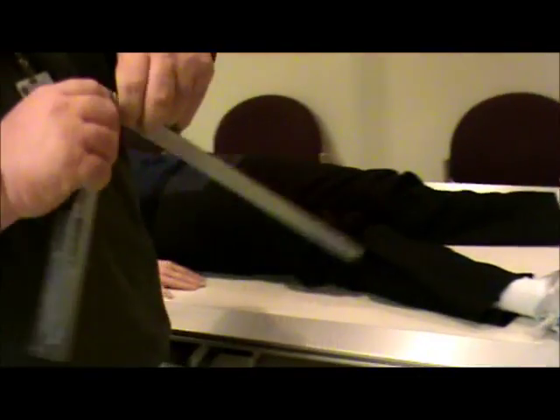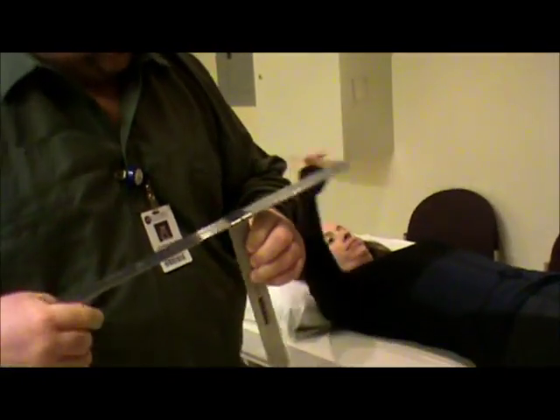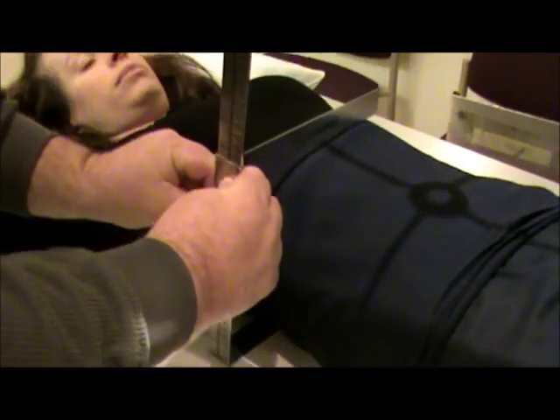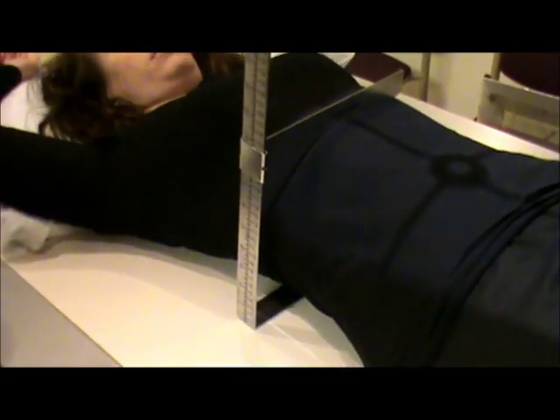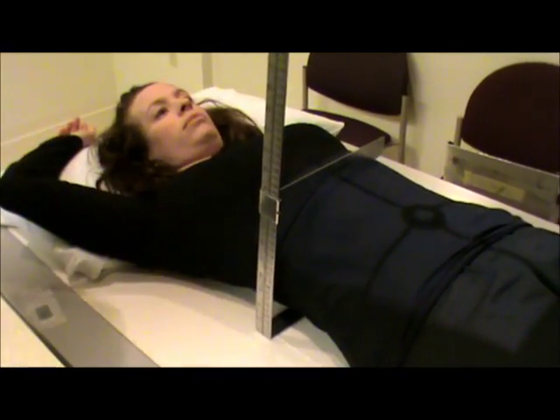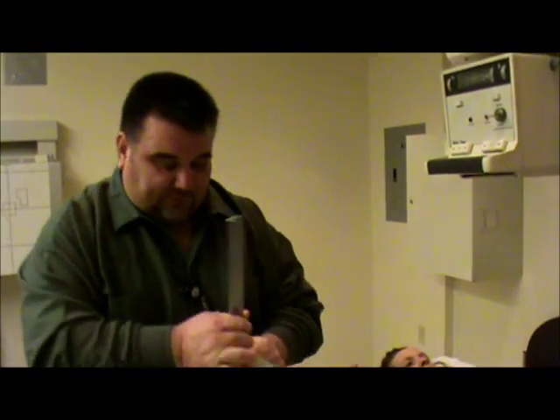This is our caliber, and we're going to measure. I'll have the patient rise up just a little bit, place it underneath them at the lower rib margins, and measure. We take the bottom number — which is 19 — and divide by three. Basing it on 18 for easier math, that's about a 6-centimeter cut. We go one above and one below, so our cuts will be 5, 6, and 7 centimeters.